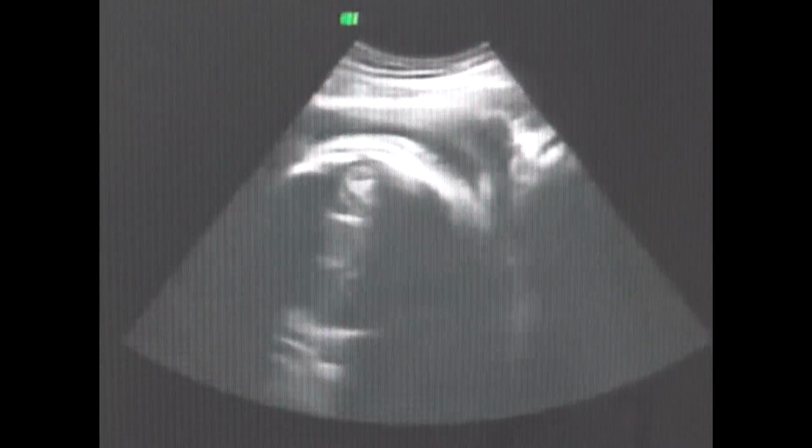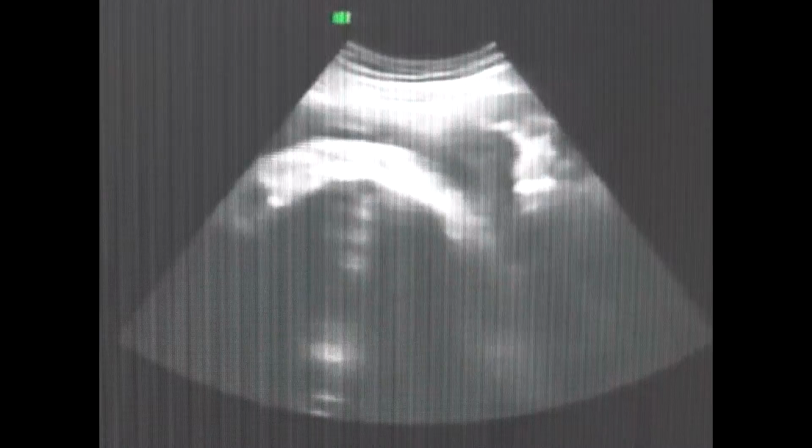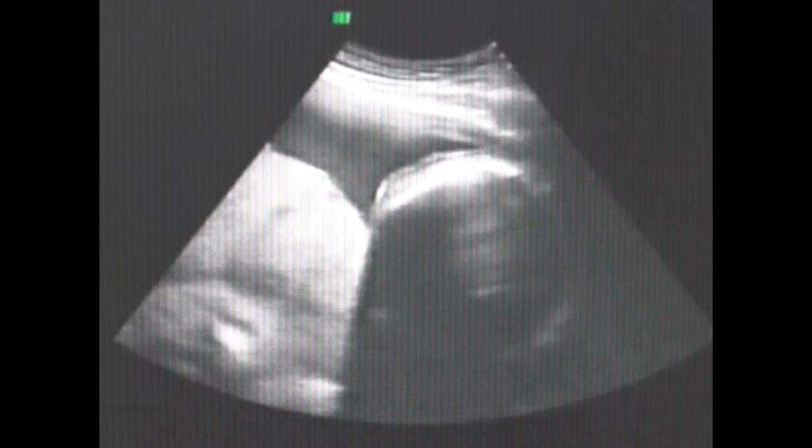She does have a little bit. Probably more than bald, yeah. No, she definitely has some hair. I would say it's more than peach fuzz too, but I wouldn't say it's much more than that. But I'll even show you. You see this one little line right here of white? See it's right on top? That's her hair. And that's actually floating.